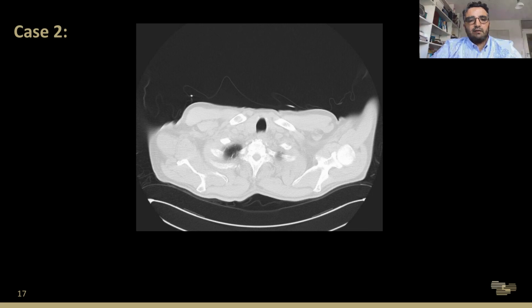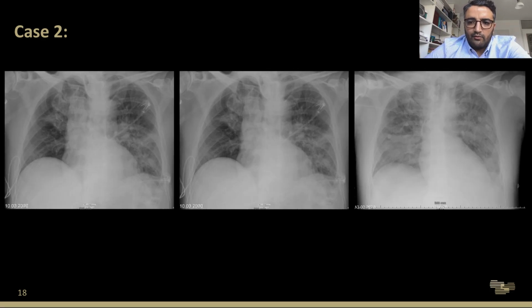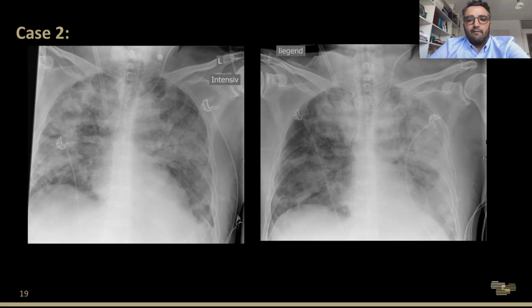And after that, this is where he got the intubation, and you can see the timeline of the patient. He got worse at this point. So he got transferred to the university hospital, to our hospital, where here you can see he had the ECMO therapy, this cannula is the ECMO therapy. And you see with the timeline, at least the right lung got better. And he survived it, and this therapy actually helped him a lot.